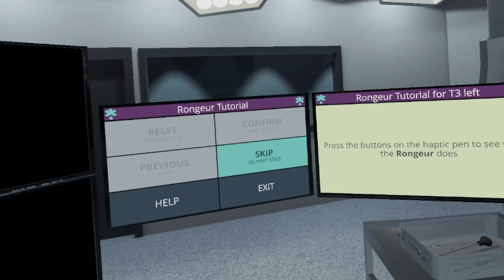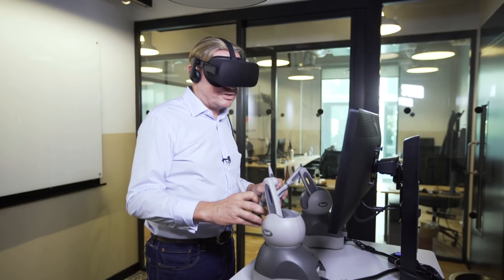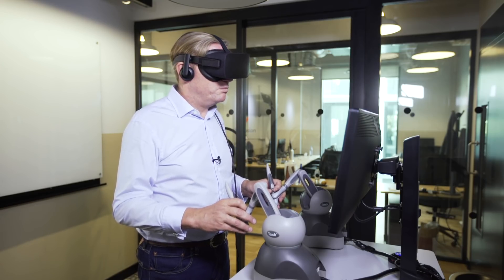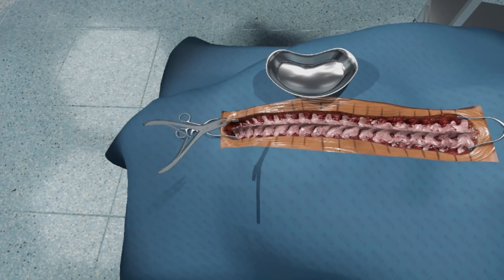Looking around the virtual operating room, I can see there are a number of different elements: a tool selection box, instructions, various machines and pieces of equipment around the room, an x-ray, and here in front of me is the patient all ready for surgery.